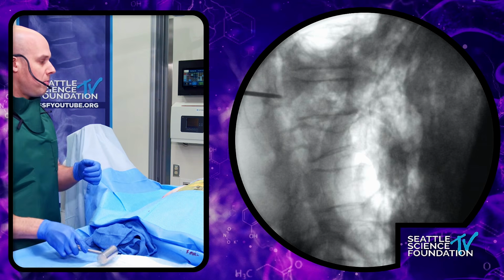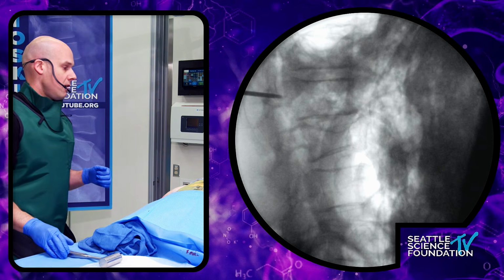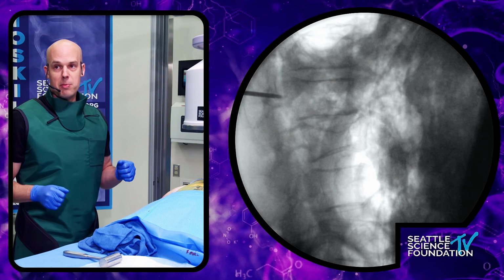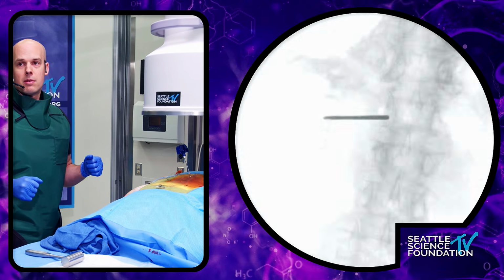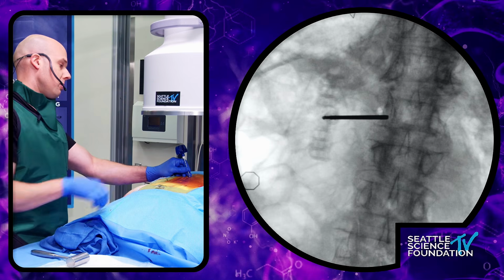So we can just go back AP just to confirm that we still have some margin with the medial wall of the pedicle. And we do. Perfect.